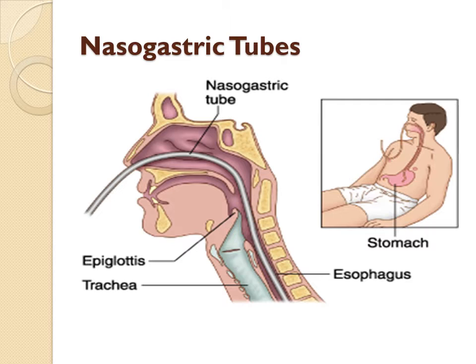So a nasogastric tube is a pliable tube that is inserted through the nares and then down the pharynx through the esophagus and into the stomach. This allows then for contents that are blocked to be removed through this tube, since they're not able to move for whatever reason, either downward because there's some kind of a blockage, and we don't want them to come upward. So since they can't move, we want to eliminate distension for the patient and give the problem area time to relax and possibly even repair itself.